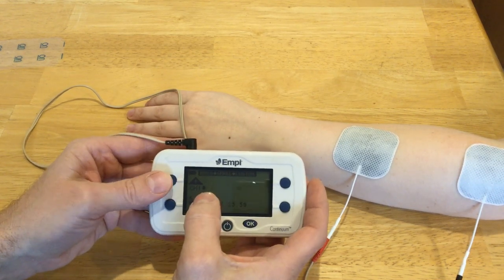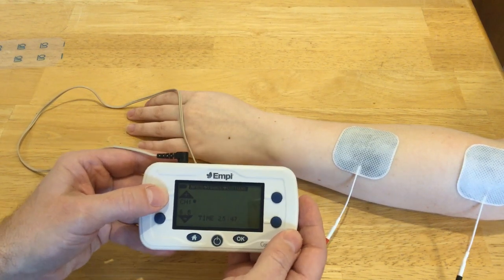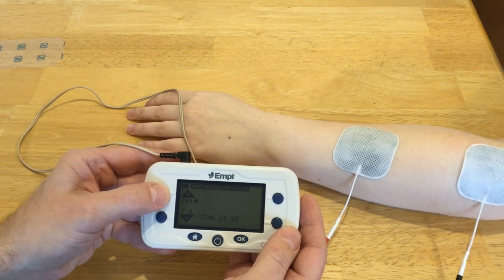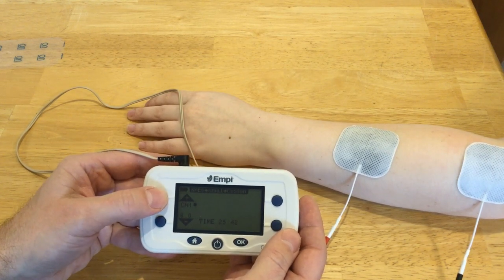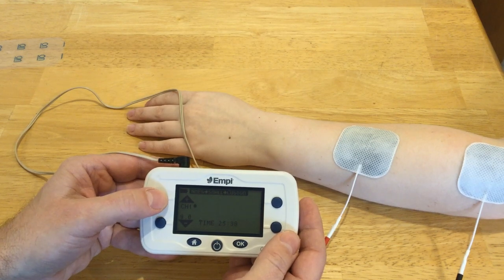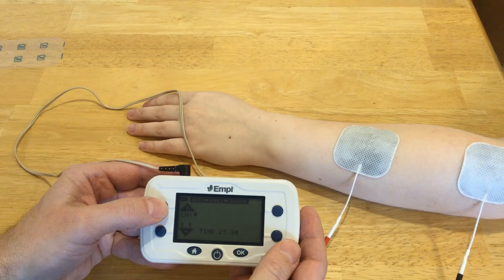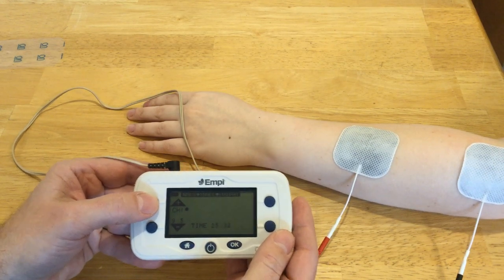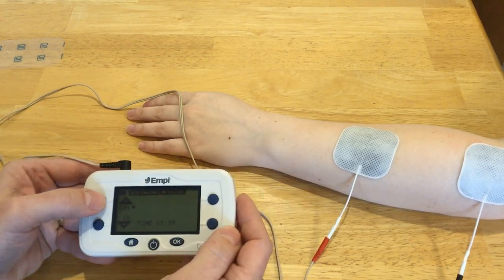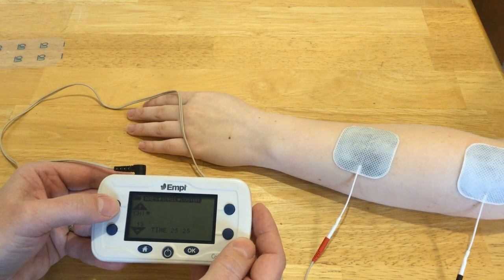While you're adjusting, that dot stays there so you can see what's actually happening — it basically deactivates the off time. Generally, somewhere in the mid-teens is where we're going to get a motor response.